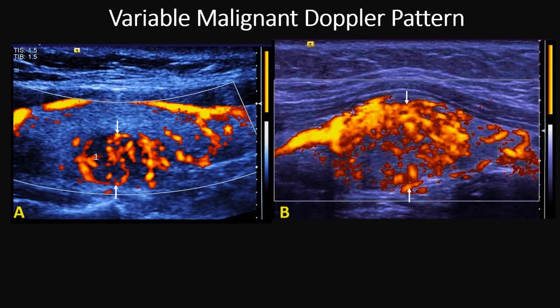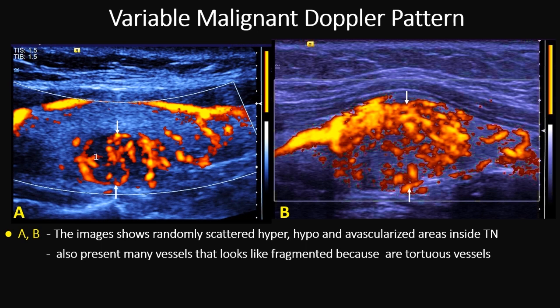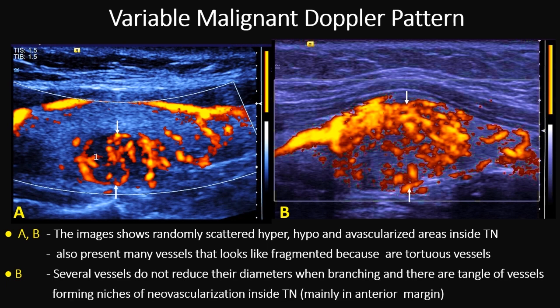In this variable malignant Doppler pattern, we have a variable amount of vessels inside. These vessels are anomalous — they are tortuous, or fragmented because they are tortuous. Also, close to the anterior portion of the nodule, there are entangled vessels that represent niches of neovascularization inside the thyroid nodule.